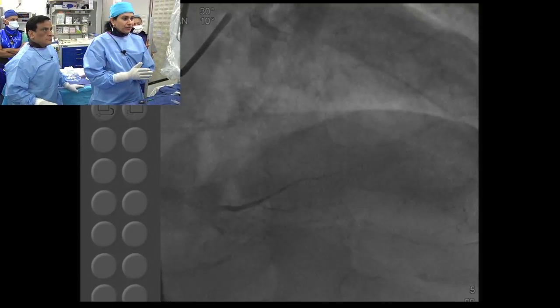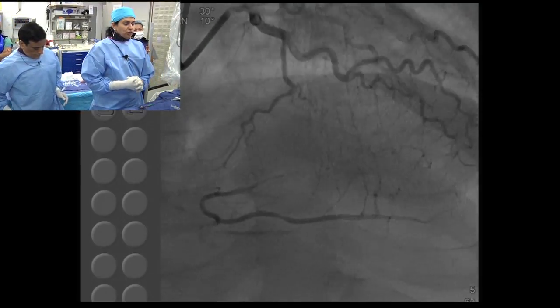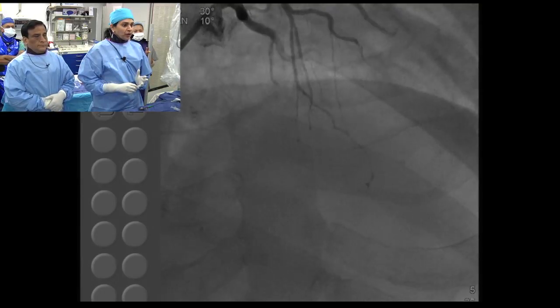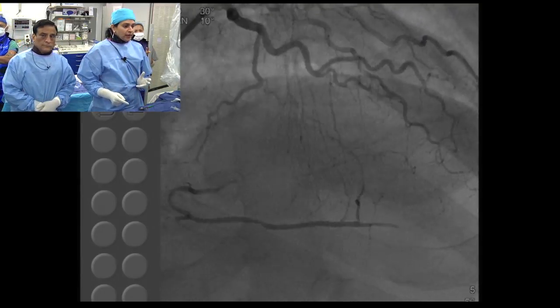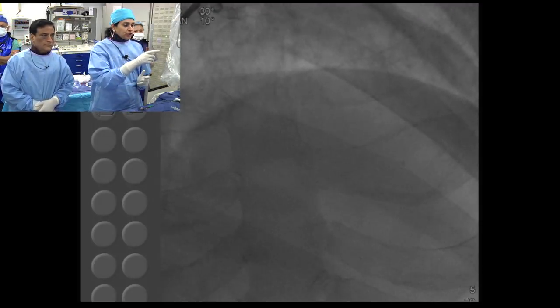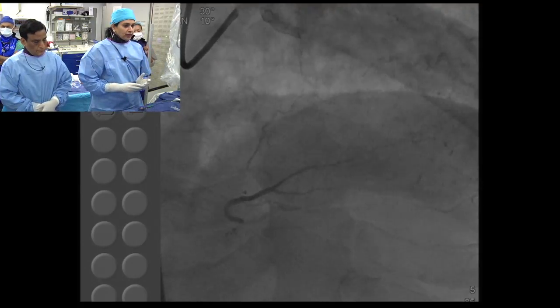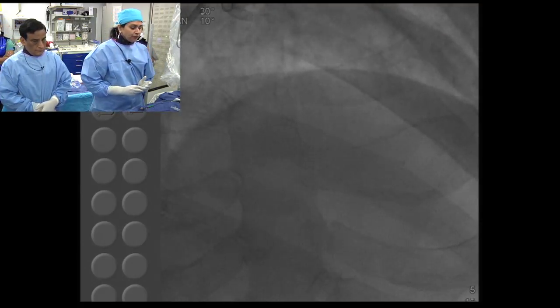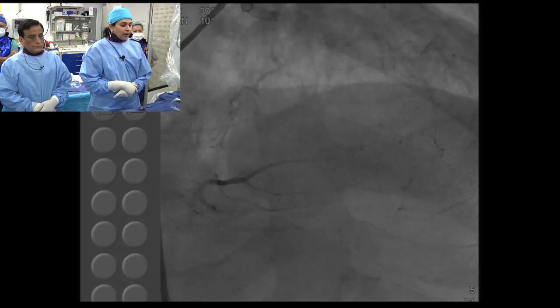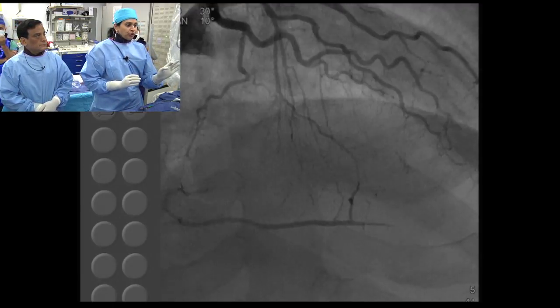It's still worth going through the septals, because many times angiographically you may not see it, but the wire will go through it. And the challenge there is, even though the wire goes, the channel dilator, which is the Corsair, may not make a turn, since your septals are curlicue. So that's the second challenge we face, that the Corsair may not make the turn into the RCA, and after that another challenge is crossing the CTO retrograde.